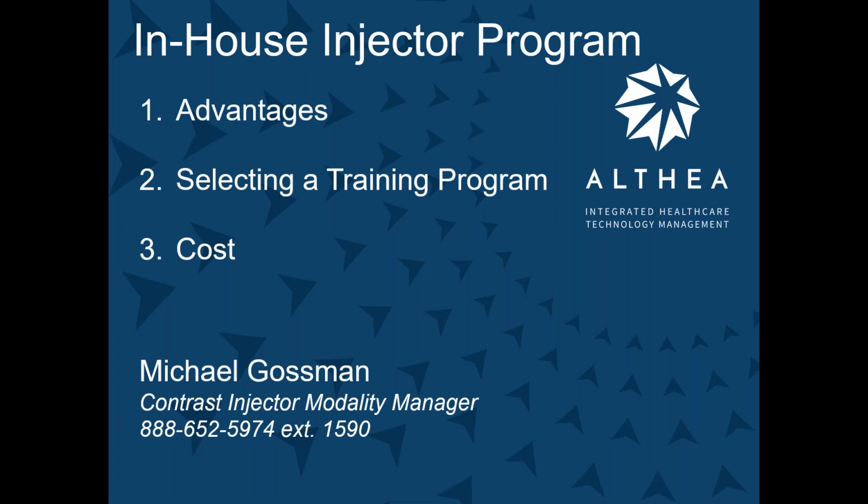Why are you going to wait for an OEM to show up to clean up a sensor? Because all he did was take a warm washcloth and clean out that sensor to make sure it sees that contrast, right? Why wait for the OEM to show up? I'll be there tomorrow morning. I need the room for 3 hours. No, you run in there between cases, you have 15 minutes, you see the contrast build up, you clean it up and you're off and running.